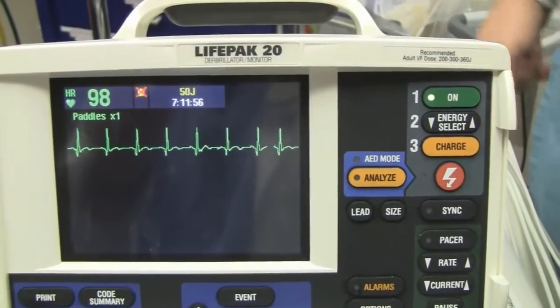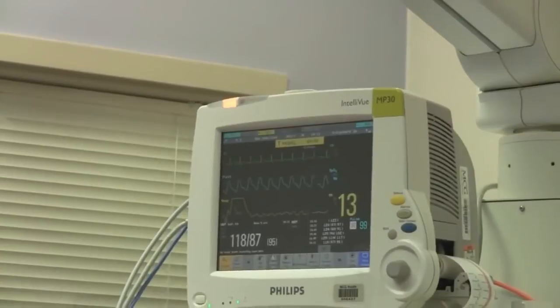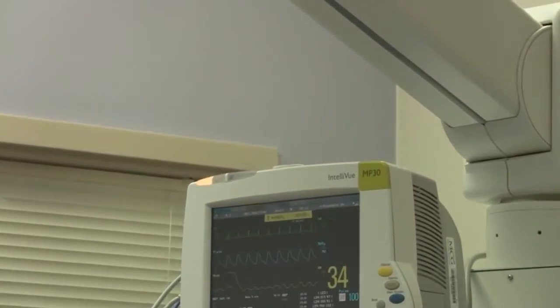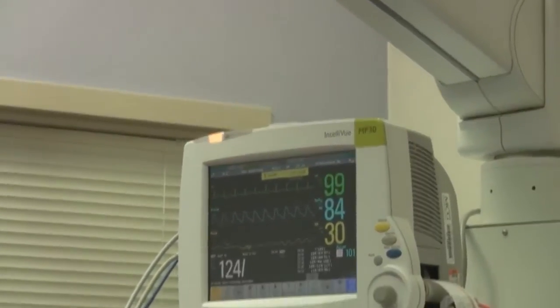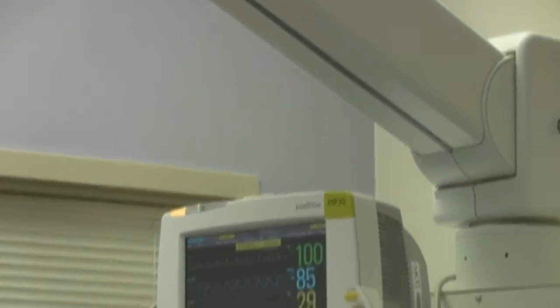Cycle the blood pressure. Heart rate? 82. There you go.